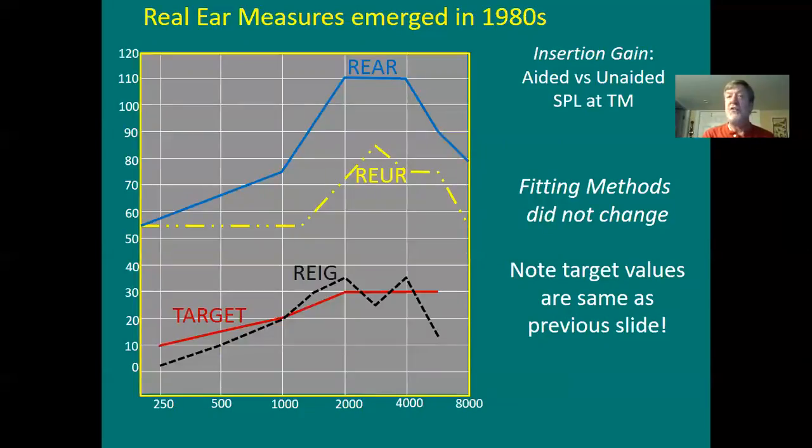Here's real ear. Same goal, same idea. It's just that instead of the guy raising his hand voluntarily, letting you know when he or she hears the tones, unaided versus hearing aid and ear aided, instead of doing that, you're just putting a probe tube in the ear canal, and the sweep tone goes right across from 200 to 5,000 hertz. And you're looking, am I getting a nice ear canal resonance? Oh, yeah, okay, cool. Save it.